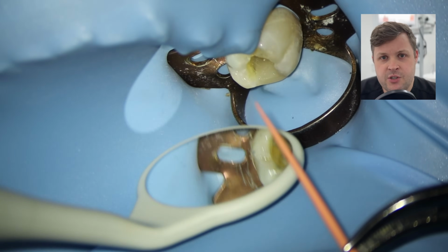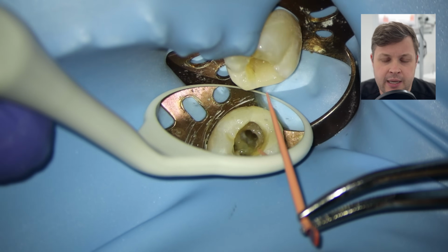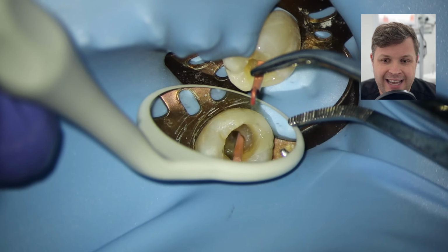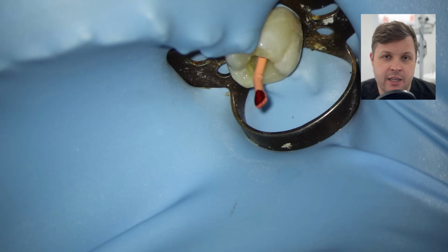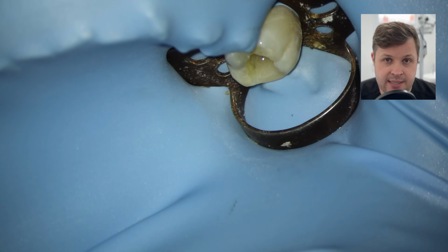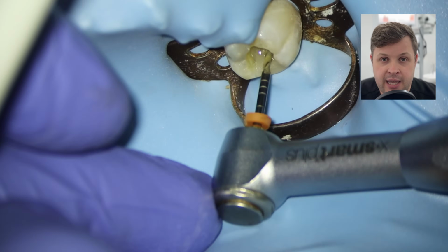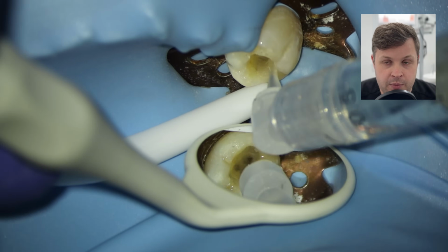So as we set up our cone fit radiograph, I noticed that when we measure our distal cone and then we push its length, it isn't quite getting to that working length that we've come to expect. So the best thing to do, if you're not quite reaching to length with your master cone, is to pull the master cone out, irrigate, recapitulate, and then just do some more shaping with the filing.